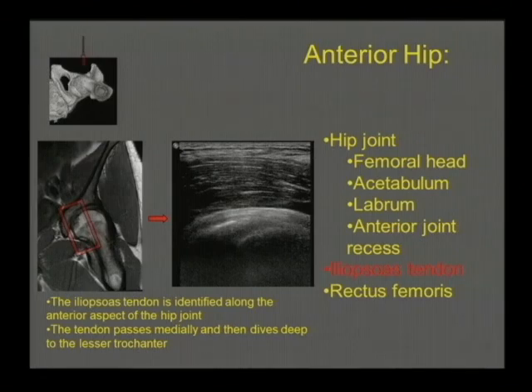That brings up another important technical point as well. With the way you want to hold the transducer when you're evaluating a patient, usually I'll just use my index and long finger and thumb to hold the transducer, and my small finger and ring finger will be right down on the patient, holding the transducer against the structure that I'm evaluating. And in that way, you can toggle the transducer, rock it back and forth, do whatever you need to do to really follow these complex structures as they curve over the bony anatomy.